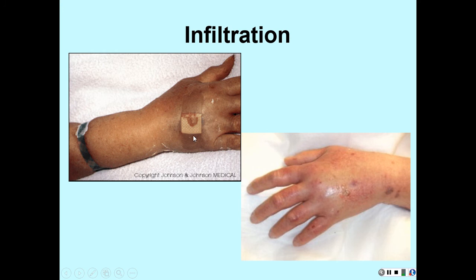All right. Look at the tape right there. I mean, what is the first thing you're going to do when you walk in and you see that? You're going to stop the IV, right? What is the next thing you want to do? You got to look. Does this woman have blood flow to these fingers? She may. She may. You got to check that.